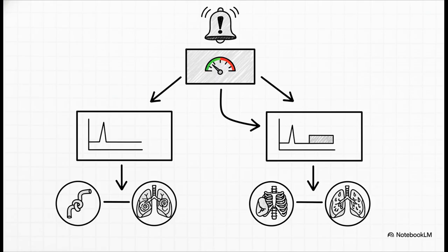And we can use these two pressures diagnostically to troubleshoot problems in real time. It's a beautifully simple algorithm. Let's say your high-pressure alarm goes off. First thing you do is an inspiratory hold. If the peak pressure has shot up but the plateau pressure is stable, the problem is increased airway resistance. Think a kinked tube, bronchospasm, or secretions.